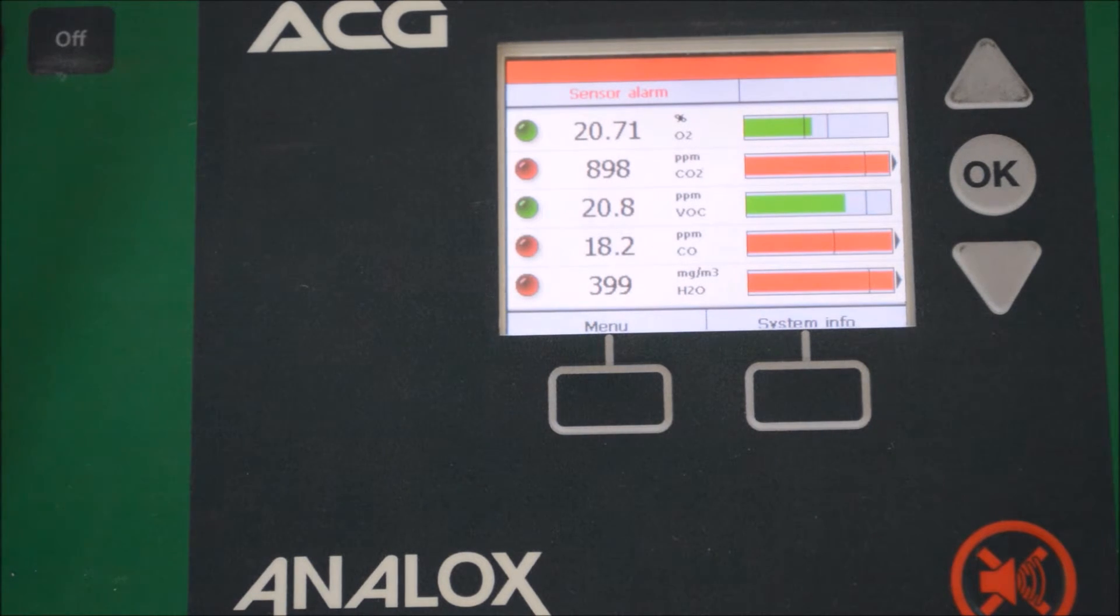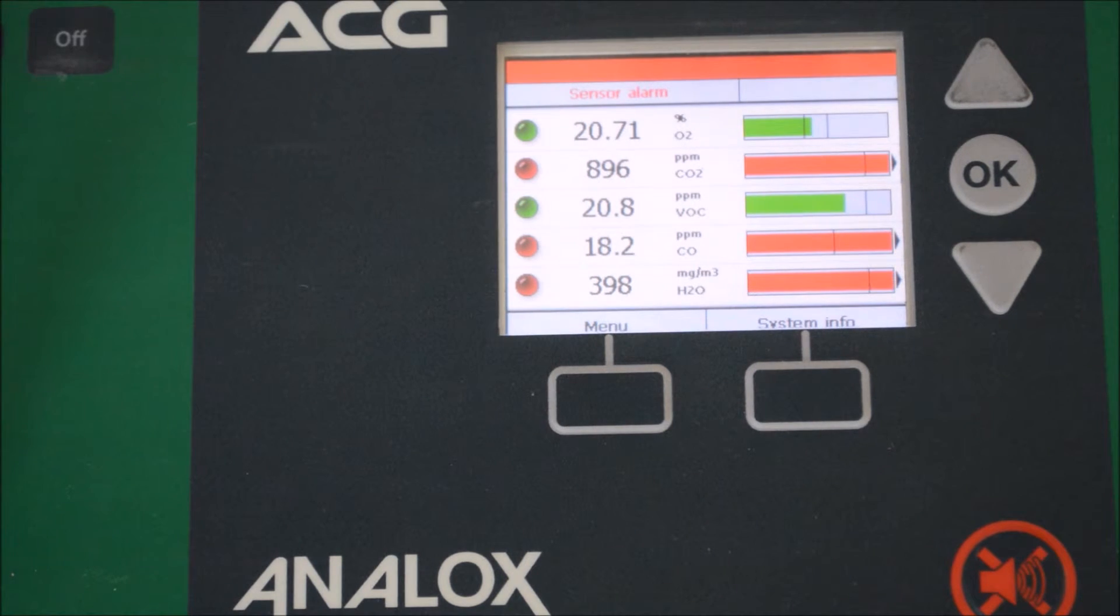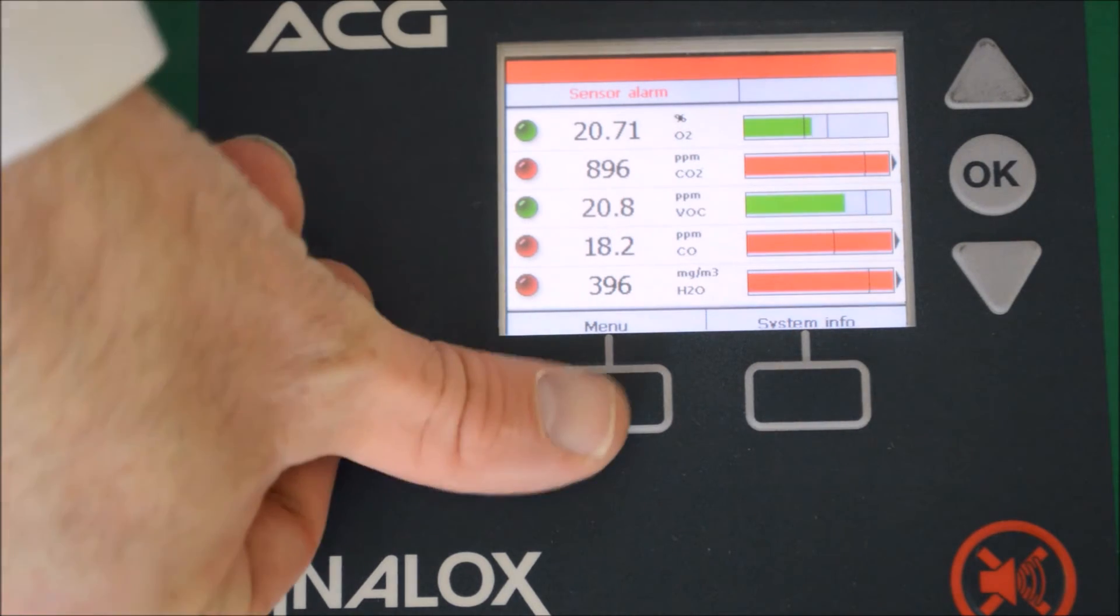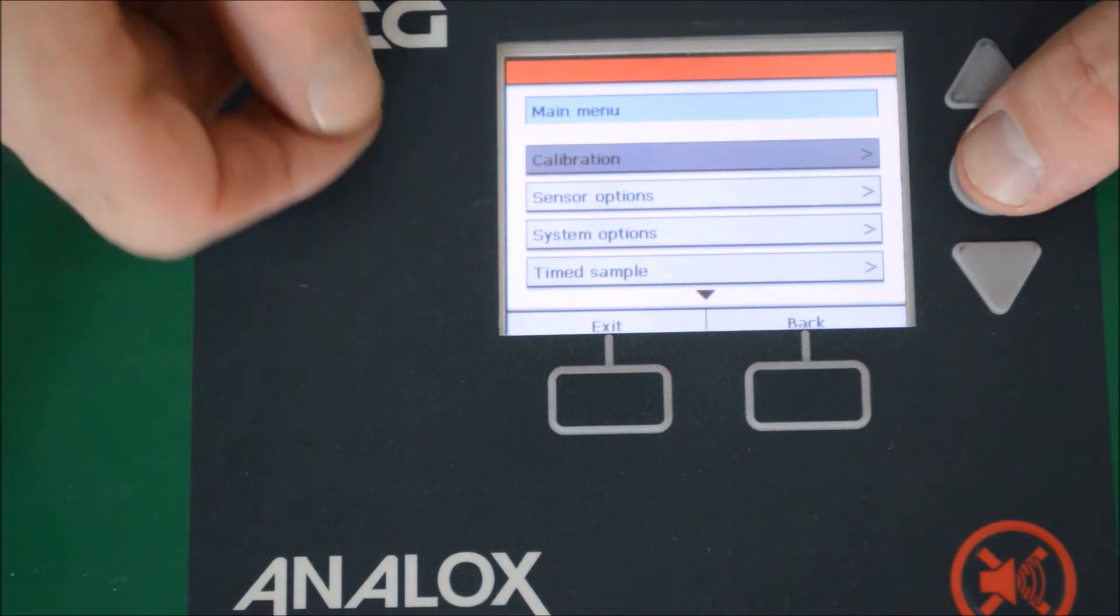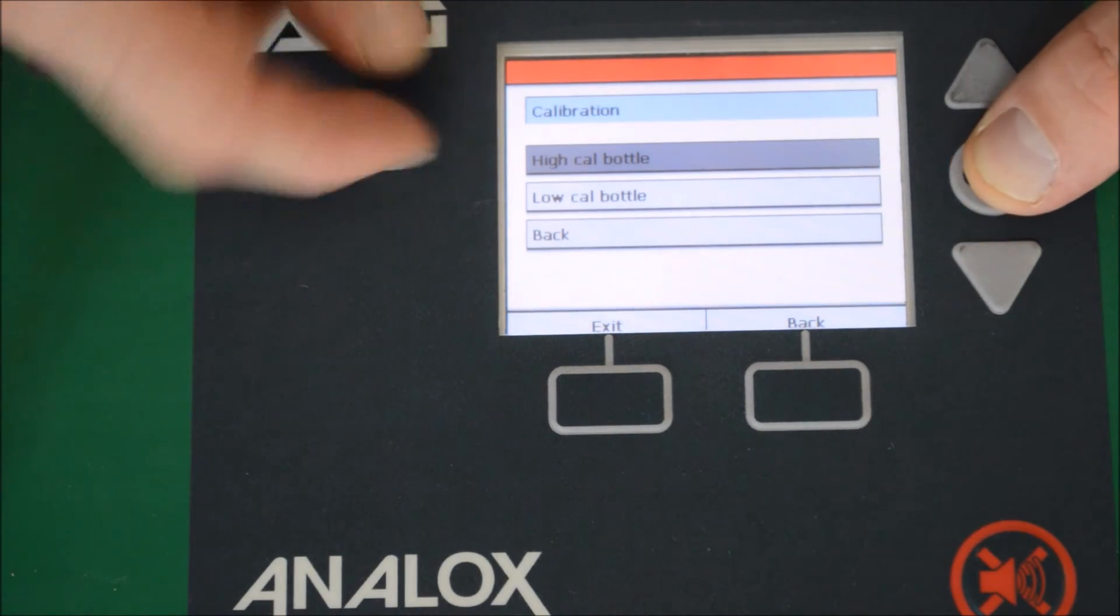We're now calibrating with the span gas. We've had the span gas running over the sensors for five minutes now, and as you can see the readings are stable. So we need to enter the menu, enter calibration, and this time we're calibrating with a high-cal gas bottle.